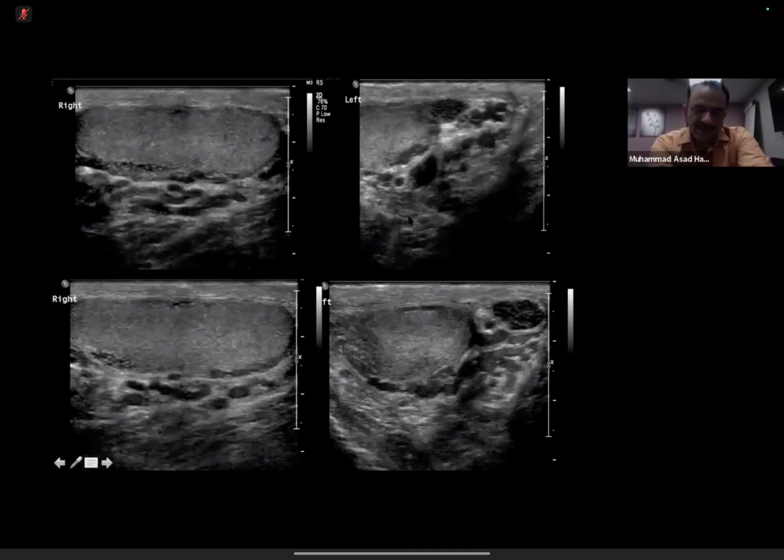You know, the usual teaching is that once you see a varicocele, always scan the kidney, especially the left kidney, because varicoceles are common on the left side. Reflux basically points out that if these are refluxing, i.e. on the Valsalva maneuver there is a reflux into them, it means it's communicating directly with the IVC.